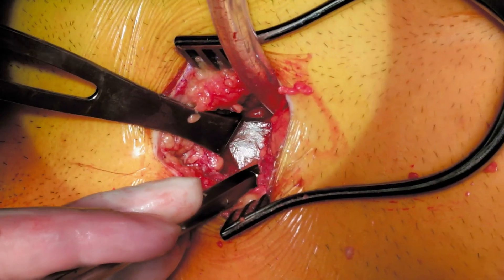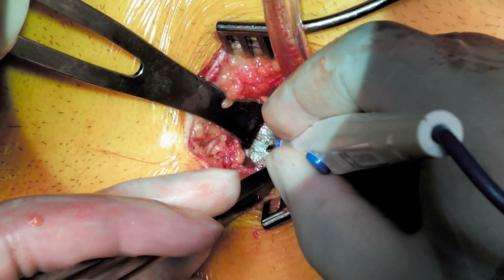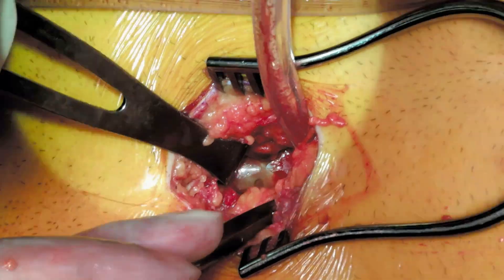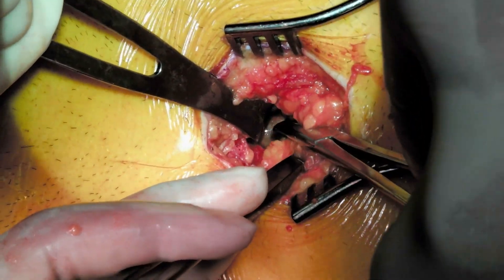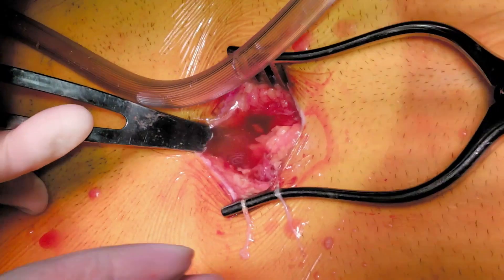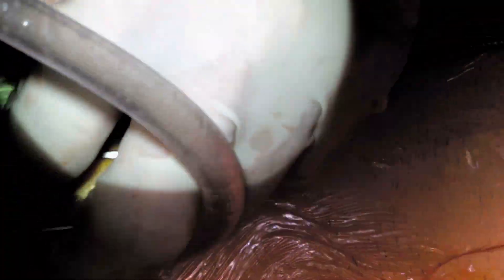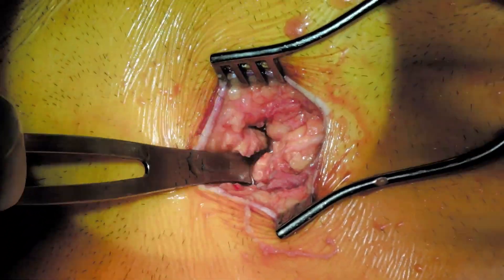Once I got good visualization of the pericardium, I take my electrocautery and open it — I enter the pericardium. You can now see that there's some fluid coming out; that fluid is the pericardial effusion the patient had. My suction wasn't working for a moment there. I'm further mobilizing the pericardium away from the remaining sternum, freeing it up with my finger.